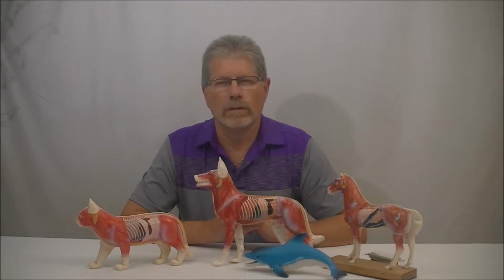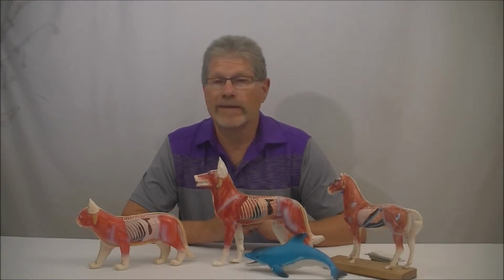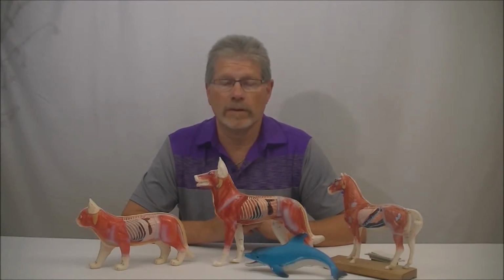The Class 2 lasers have a completely different approach to it, and they do not heat tissues up. Basically, their basic function is to improve cell-to-cell communication and improve cell rehabilitation. So, if you've got damaged cells that you can rehab, it will help. A lot is not necessarily better. A lot of power is not the answer to many of the situations they face.